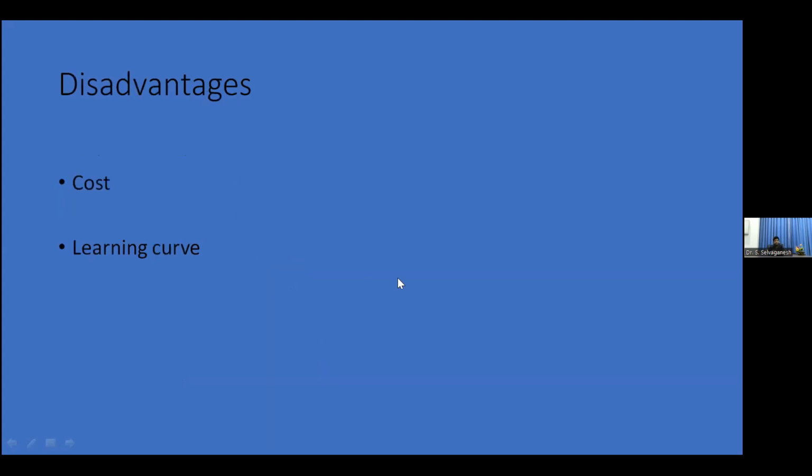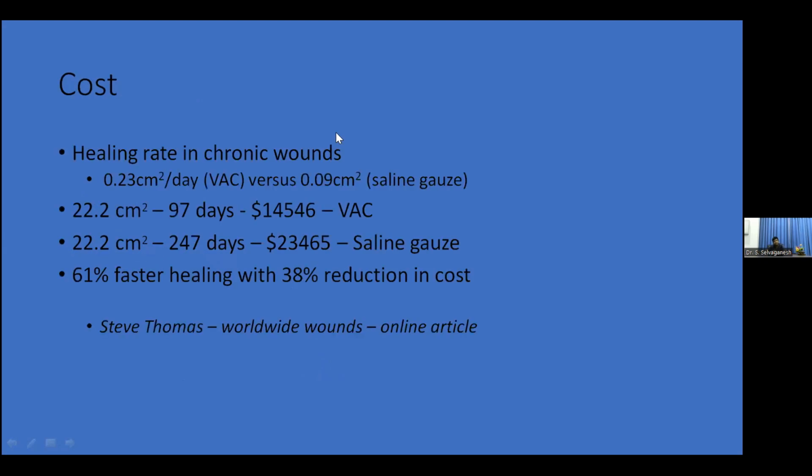So the disadvantages: it is costly, a bit costly, and you need some training for the application. You can't just apply it like other dressings. You need a bit of training.